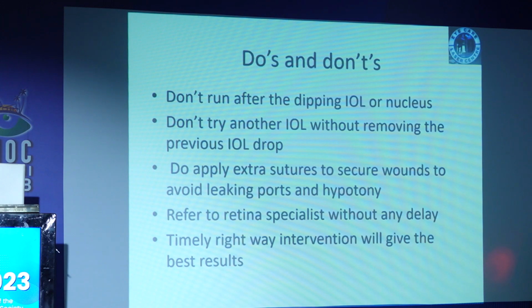Do apply extra suture to secure wounds to avoid leaking ports and the hypotony. Once I got a referral from the nucleus drop, IOL drop. So he didn't put any suture, the eye was almost collapsed. So even to give anesthesia and all this has become a problem, and choroidals are very high chances in those cases. So we can avoid these problems.